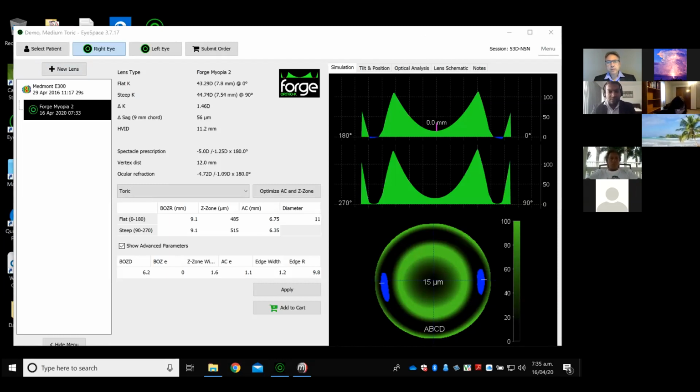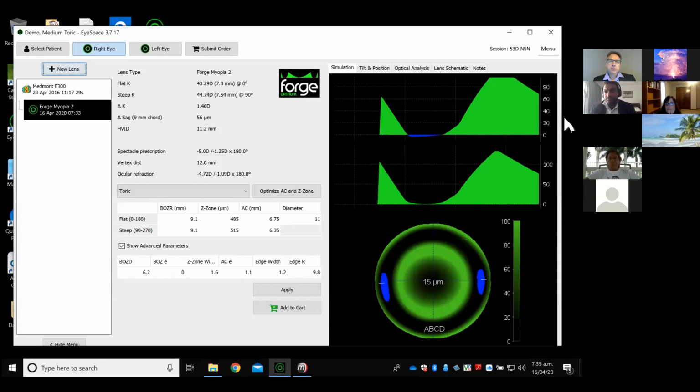And we'll talk a bit more on this as we move into Bespoke. But for any corneal lens, it's important that the weight bearing is over the horizontal meridian. It stops the lens from lateral movement, but it does allow that slight up and down movement with the blink. The next step that we will then look at is the edge lift. In this case, we're aiming for about 80 to 100 microns of edge lift.